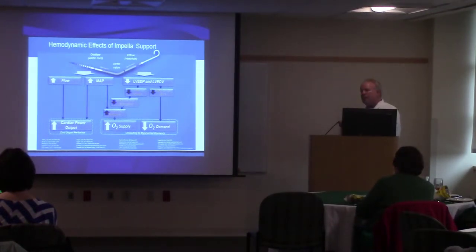Okay, so by taking the blood out of the heart and injecting it into the body, the pressure inside the heart itself is lower, which the heart likes a lot. So the heart doesn't have to work as hard when there's less pressure inside the heart, and then we can get more blood supply to the heart itself, which allows the heart to rest.